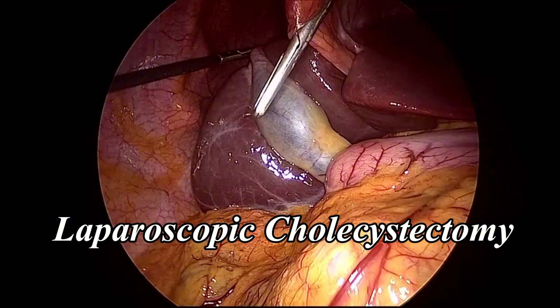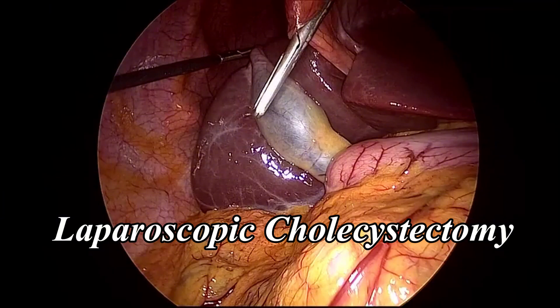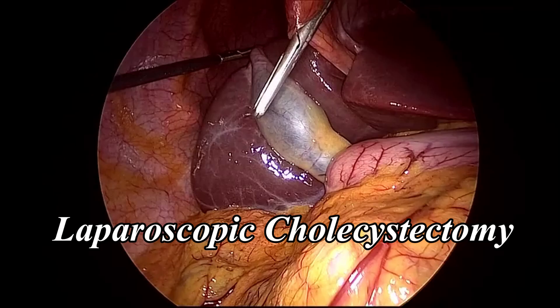Pearl: inspect the liver bed and clip sites carefully for bleeding or bile leak before closure.